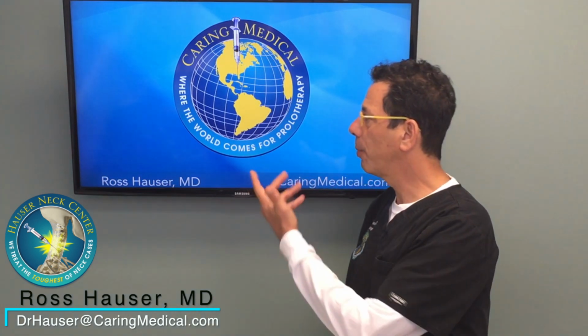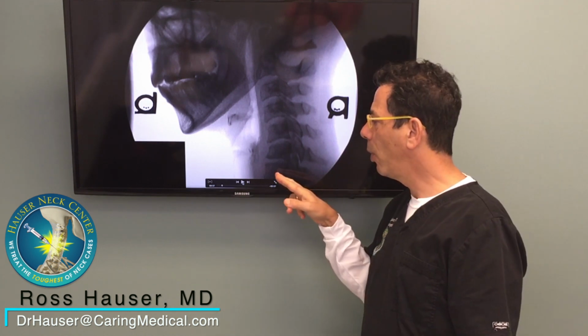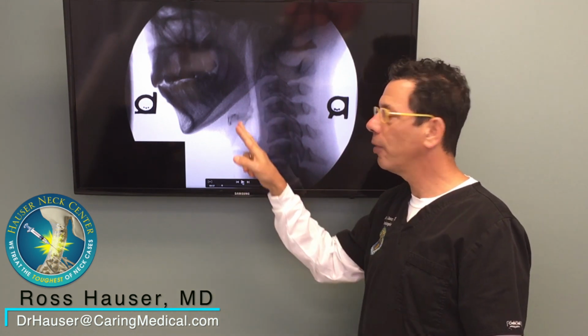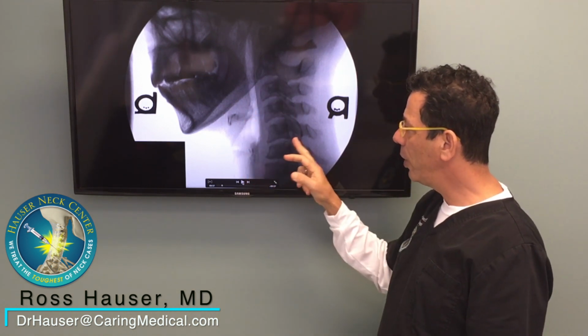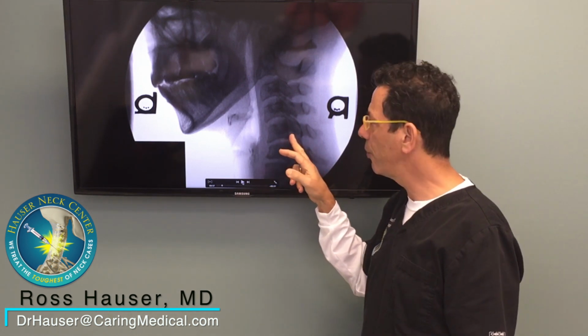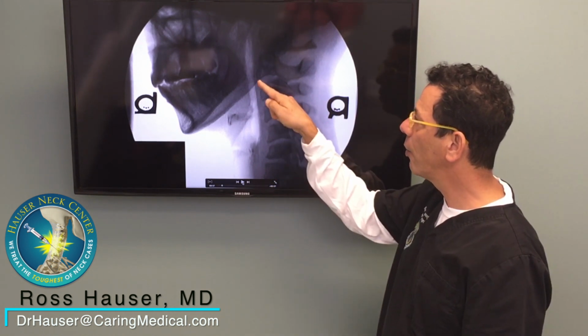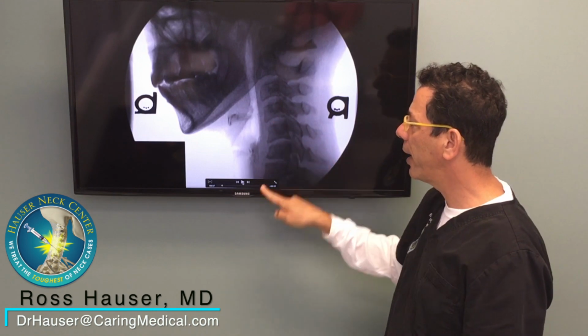So I'm going to now present a part of her digital motion X-ray. We see in her still here, it's just a lateral view of her cervical spine. We see just how terrible the curve is. Now, most people, their curve is supposed to be a C. It's supposed to be a C. And C right here, we just call this a reversal of the curve or kyphosis. So in other words, her curve, if you will, goes like this, then it goes like this, and it goes like that. So we call that an S curve.